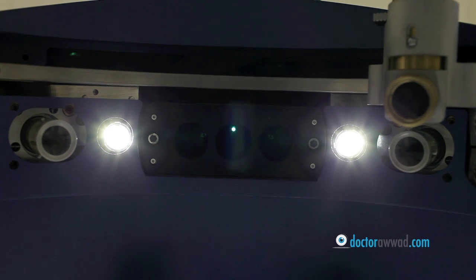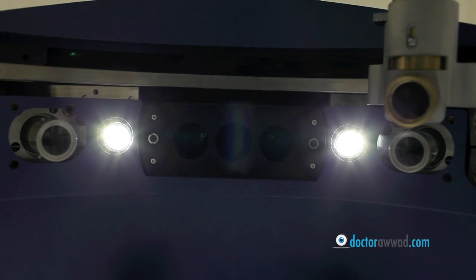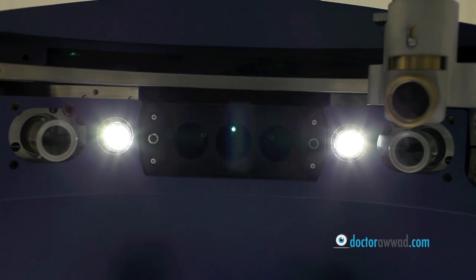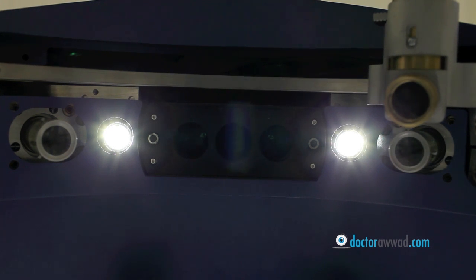You will then feel a pressure over your eye and vision might become dim or even black out for several seconds. Try not to move during this time. Vision will come back right after. When it's time for the excimer laser to work, you will be notified and you will be asked to look at the blinking light at all times. Rest assured, the laser will follow your eye in case it moves and will completely stop if your eye moves far out.